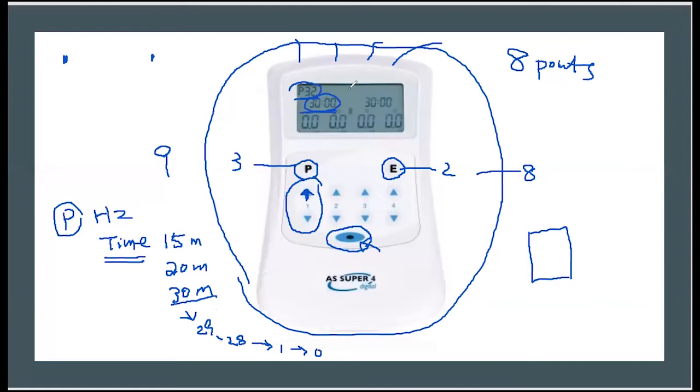The time controls are separate: these two wires are here, and you can separately adjust the time on the other side, for these two wires. So truly at different points, you can use different times. But the program is the same for one machine. So that's basically it.